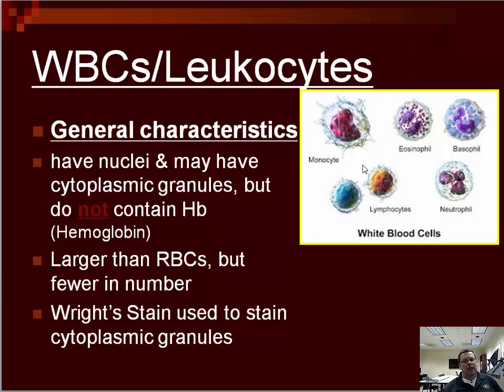So on the other side here, you have white blood cells: two lymphocytes and a much larger monocyte. These you've probably heard of before. There are two types here: monocyte, lymphocyte. These are the agranular leukocytes.